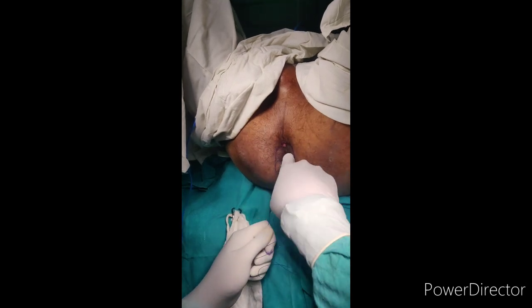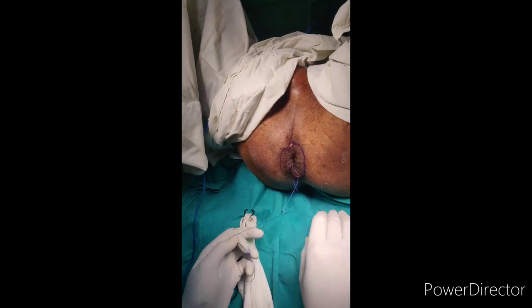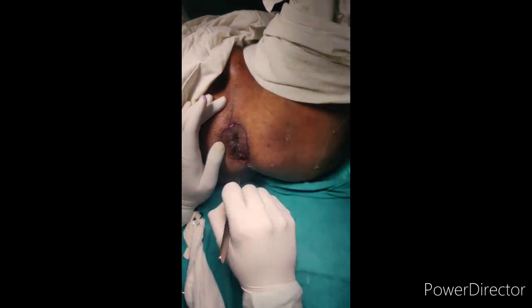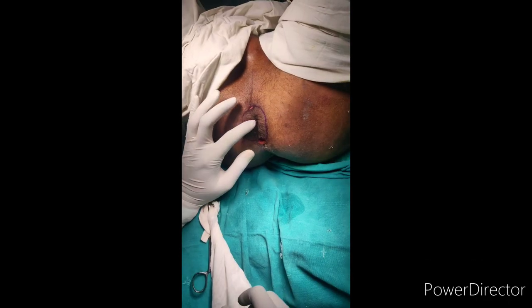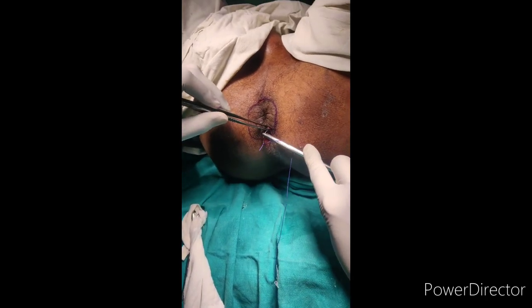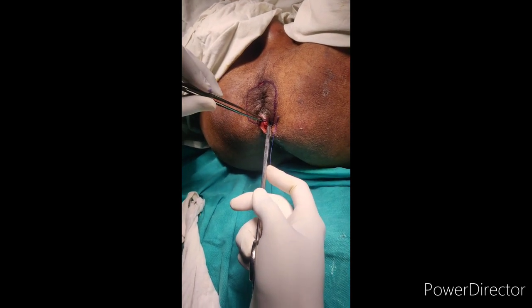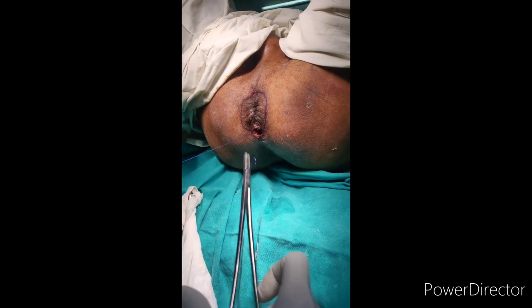For reconfirmation, first pass one finger then two fingers. Once you have confirmed that two fingers are easily passing, cut the knot. After cutting the knot, direct the knot to the nine o'clock position so that the patient will not have pain at the site of operation postoperatively. Close the sphincters that were opened — we had opened the superficial external sphincter at the entry point — and bury the knot. After burying the knot, close the skin with Ethilon 2-0 to complete the procedure.